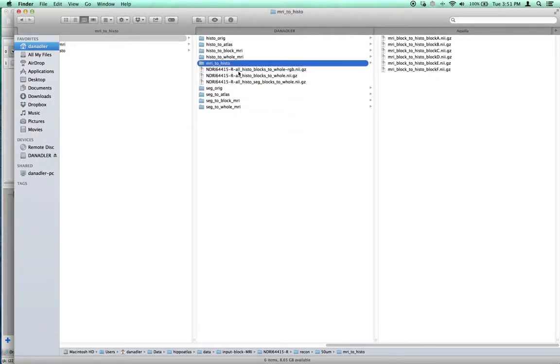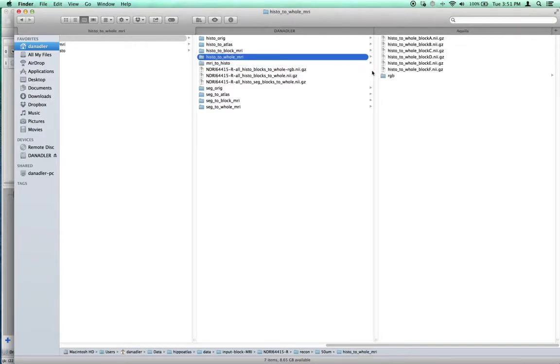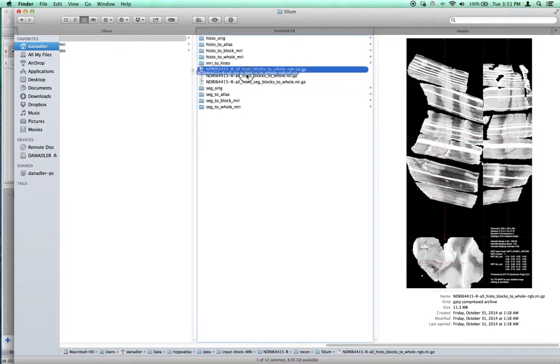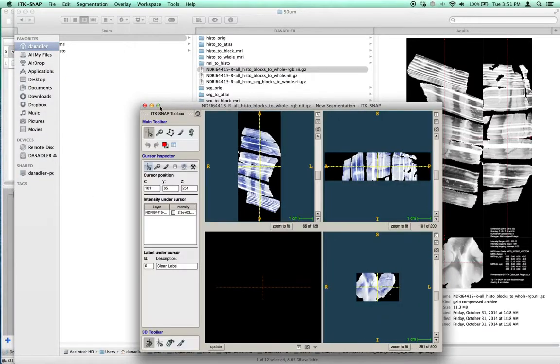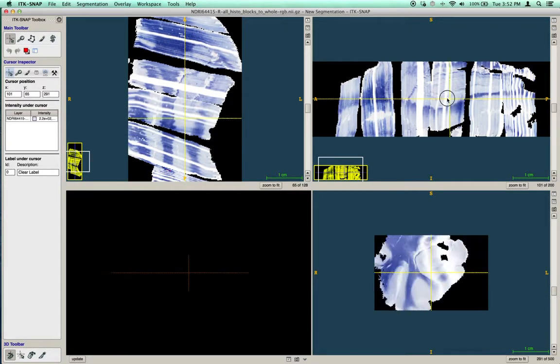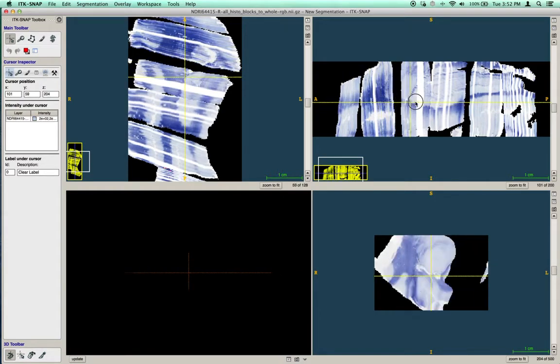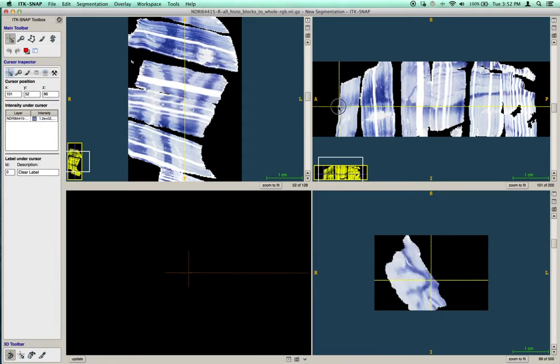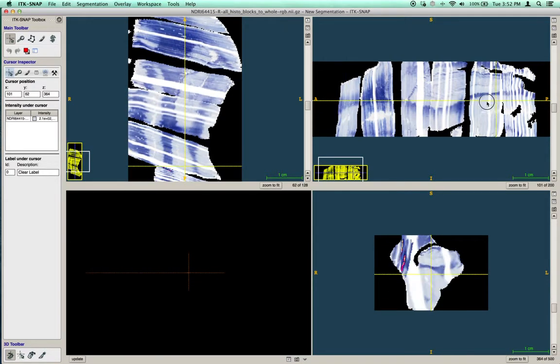And extending this further, we can actually show alignments between our whole histology block, our whole tissue specimen, and all the blocks. So this now incorporates some warping out of plane. This is a reconstruction of all histology samples now to all the blocks warped into the space of the whole MRI image, not just the block MRI images.